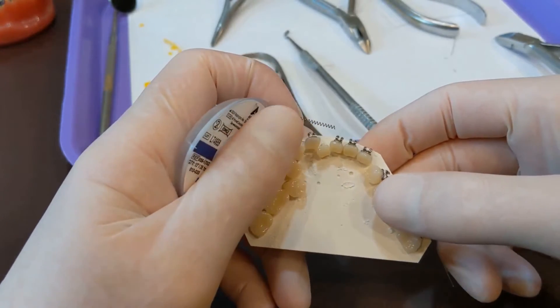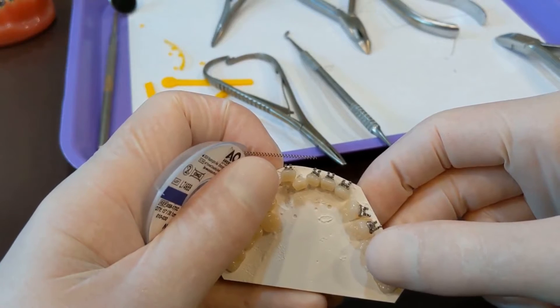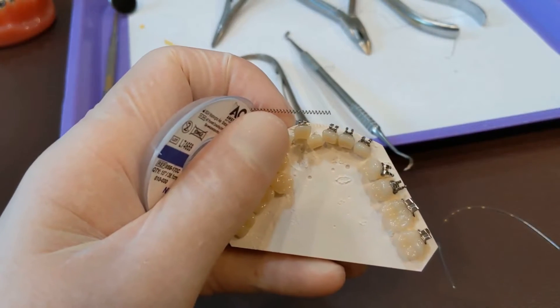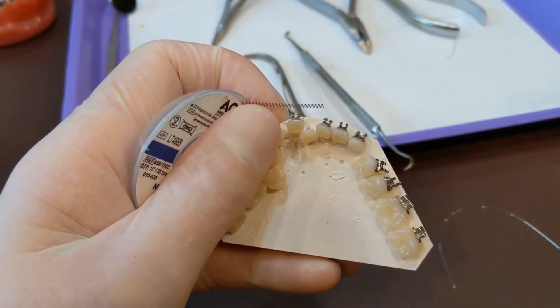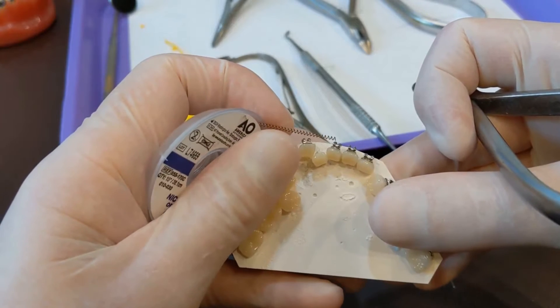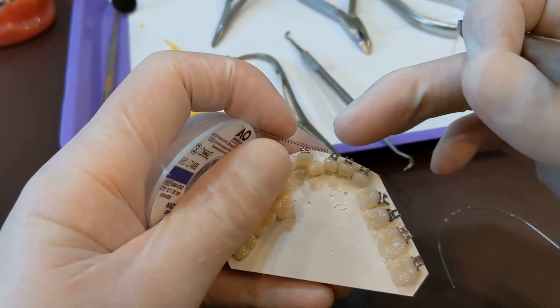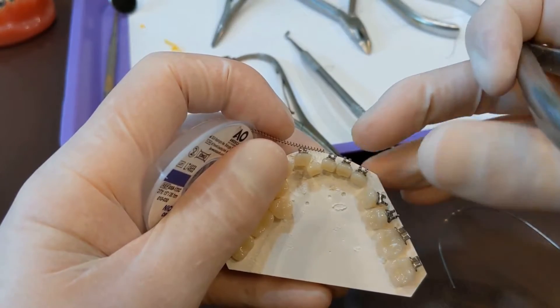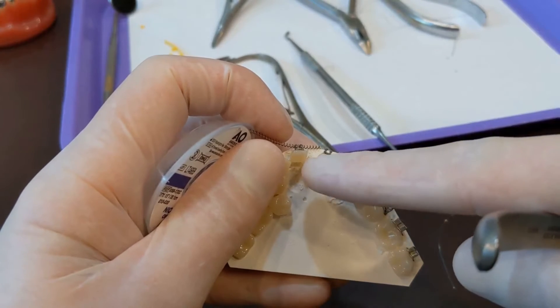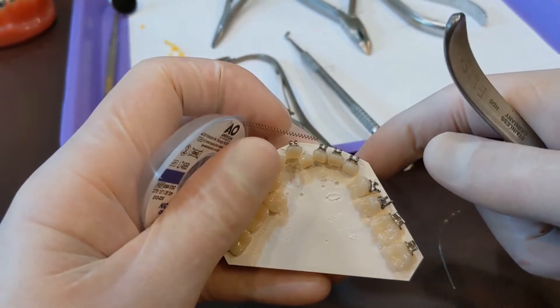What you do is usually activate at one bracket's width. What that means is you'll take your open coil spring and hold it up to the side of one of the brackets. So what I would call for as the doctor is I would say let's open coil spring that lower left one — because this is the lower left one right here, the one that's back — one bracket's width active.